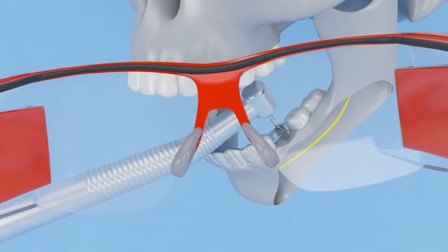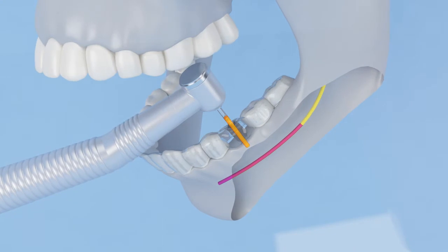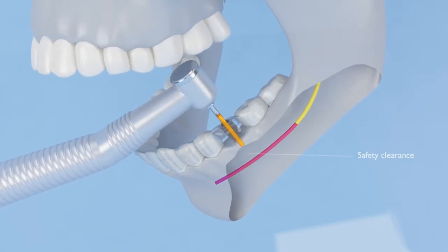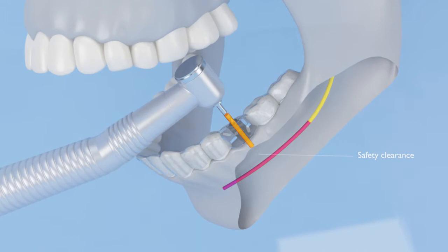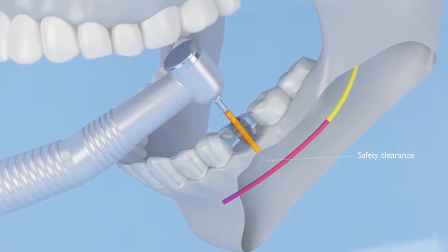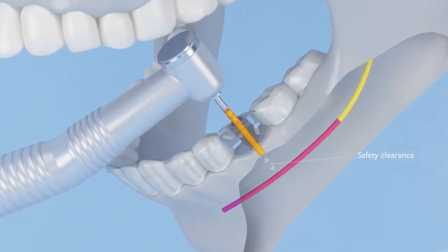The virtual overlay offers unobstructed views and provides an indication of the distance between the drill tip and the nerve in real time, so the prosthodontist is constantly aware during the critical drilling phase, making the procedure considerably safer.